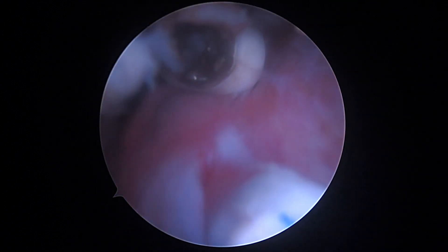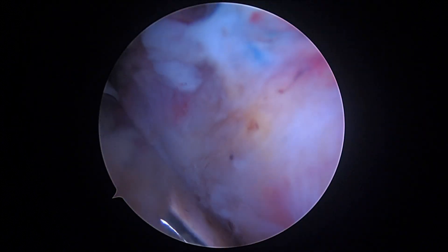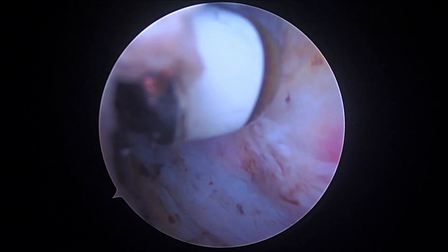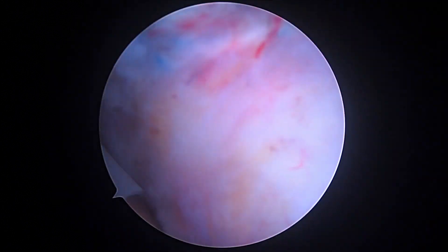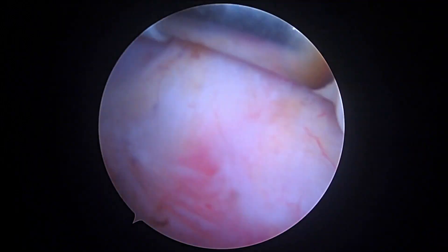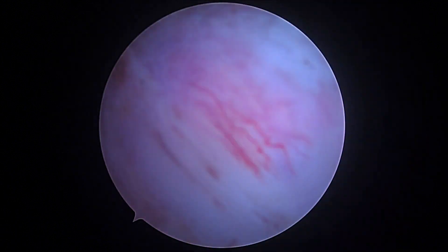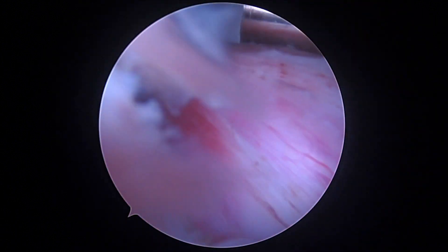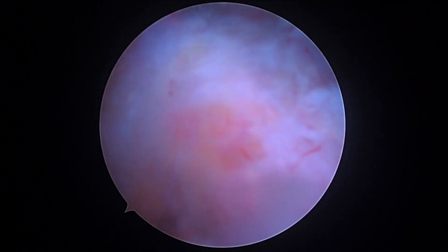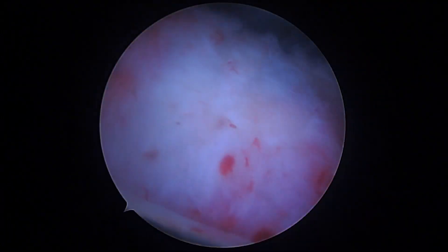So again, we're just trying to clear the picture up for you. That looks good. If there is a tear, it would be down here, lateral to that. So far so good. As we sit here and rotate the shoulder — this is internal rotation — this would show us the very back of the tear, and I'm seeing tendon tissue all the way across. External rotation this way looks pretty good too. I think that stitch is looking good.